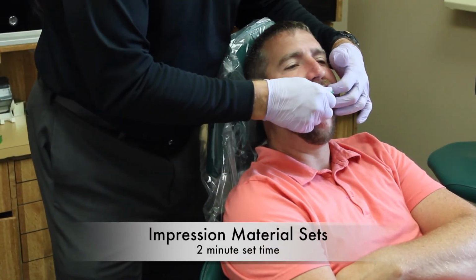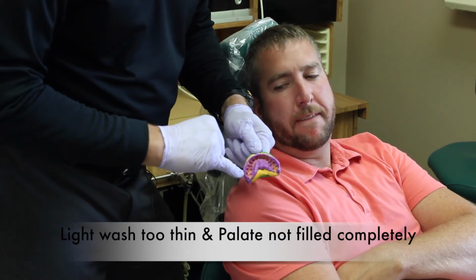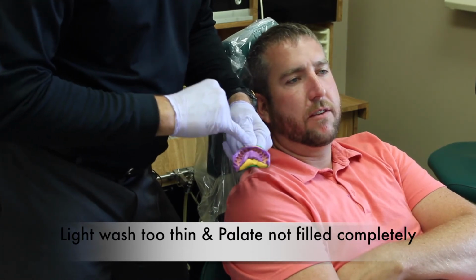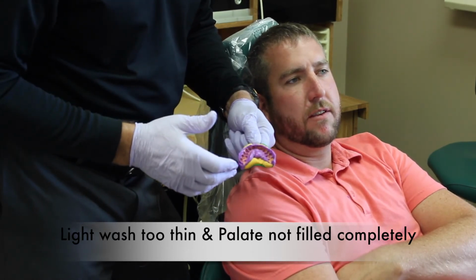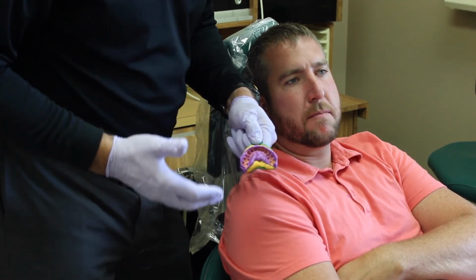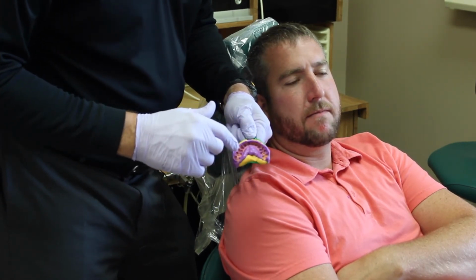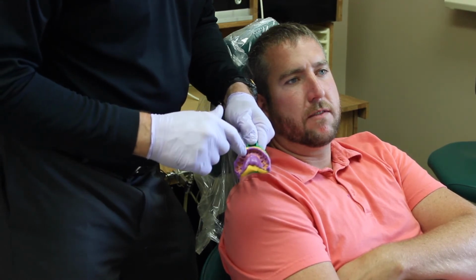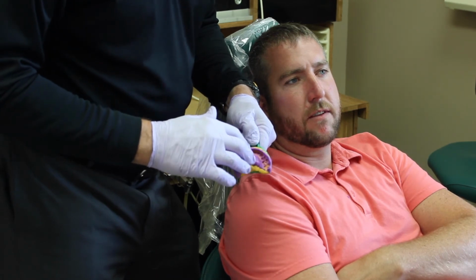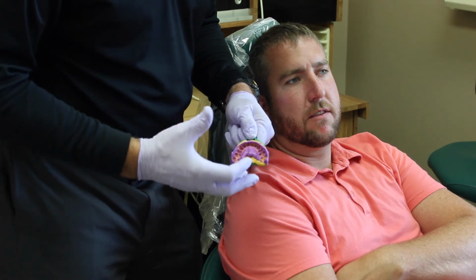So now we're going to remove this impression and we'll take a look. You can see that it's filled in a little bit of these back corner areas for me pretty nicely, but it's a little bit on the thin side. Also up in here in front. Thank goodness those aren't terribly critical areas for this type of impression, but I haven't come anywhere near filling the palate. Now I may still get away with an impression like this once in a while. It depends on how much coverage we've got with the type of appliance that we're using. In this case, if we're using a Micro 2, which is lingualist and doesn't take up as much space, then I'm probably still going to be okay in terms of my coverage in those areas. But it just makes it so iffy when that first tray doesn't really cover the area you want to see.